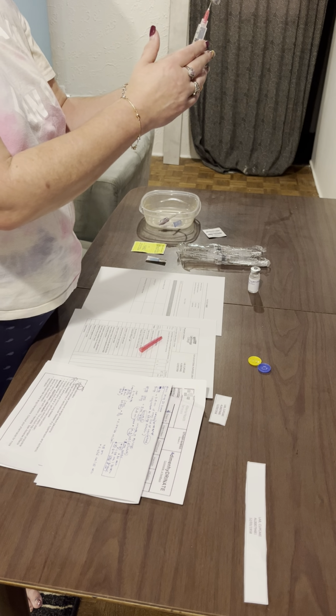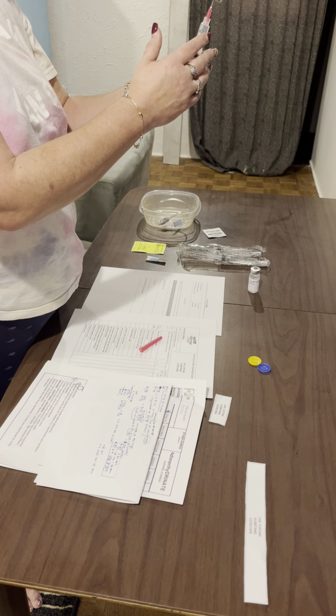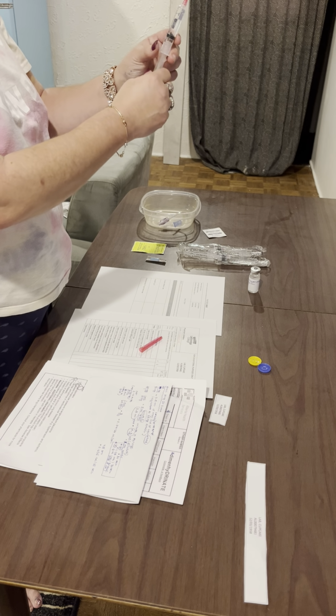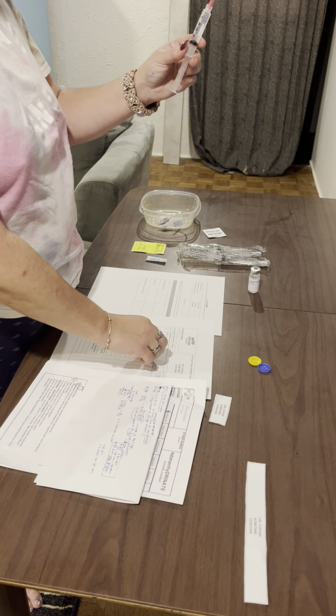Like I said, we're going to assume that we've discarded all of this and done the whole process again. And even though this has a huge bubble in it, we're going to assume that this is correct, and this is supposed to be the 5 milligrams.